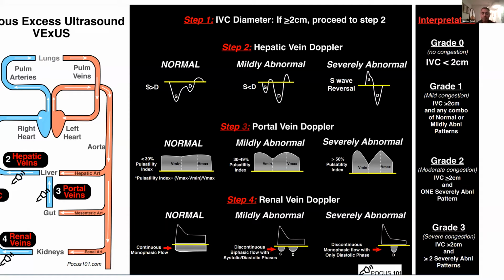It's kind of gone by the wayside recently because when we initially started looking at the IVC, it was being used as a way to resuscitate a patient. Is this patient dry or not? It turns out that's overly simplistic. So why is an IVC collapsing, or why is an IVC big and dilated? The things that drive IVC physiology are multiple.